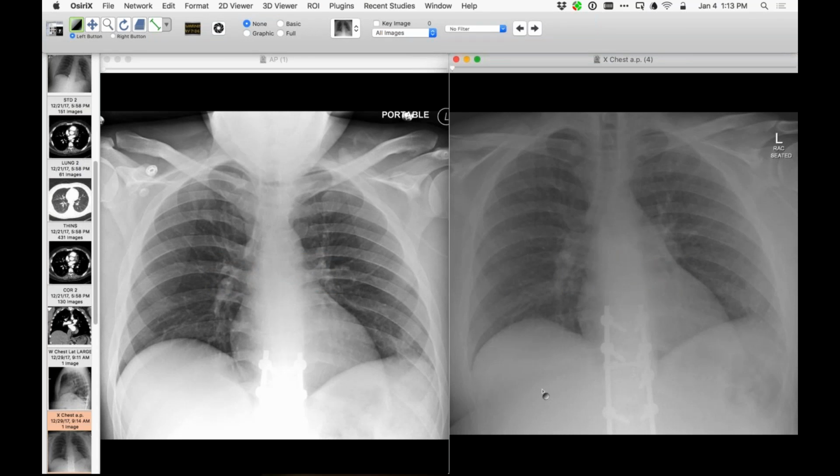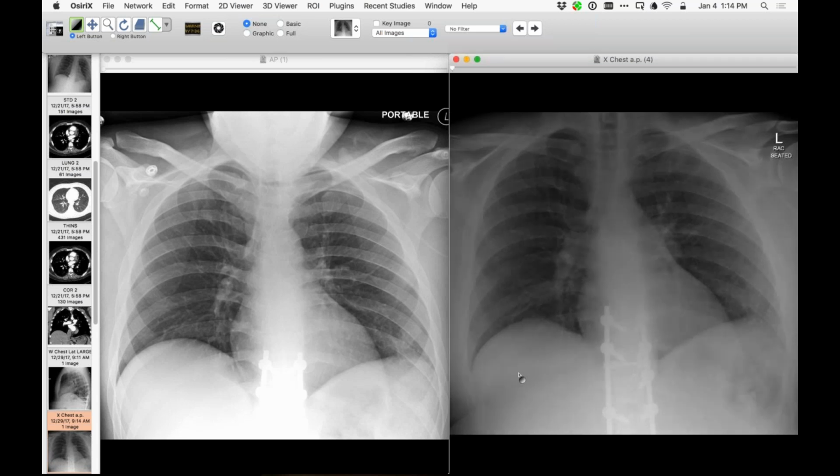And one thing that you'll see that plays into this is the fact that currently the pulmonary arteries are enlarged, and he is known to have pulmonary hypertension that's new from before. And there's some history that I'm going to withhold for a moment that plays into that. But I did notice in medical records recently that while he was known to have pulmonary hypertension, they weren't entirely sure of the etiology of it.